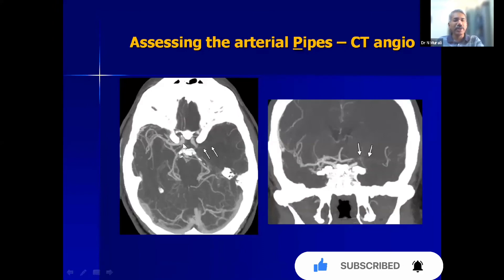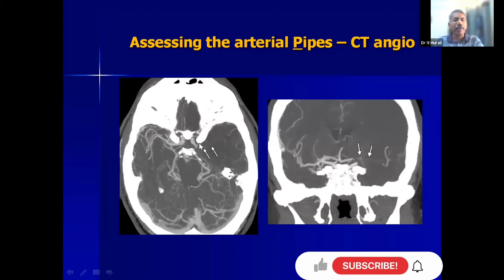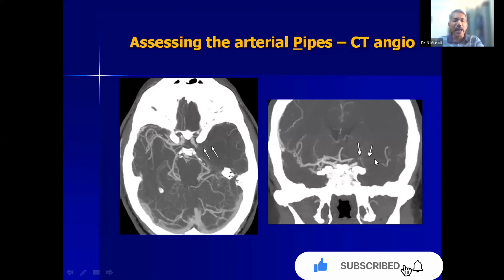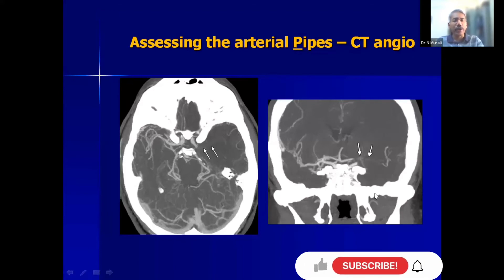On CT angiography, you can see the internal carotid artery and right MCA nicely, but the left MCA is not seen at all — distally only some collateral filling is present. The left middle cerebral artery is absolutely blocked from its origin. This is one of the ideal candidates for neurointervention.